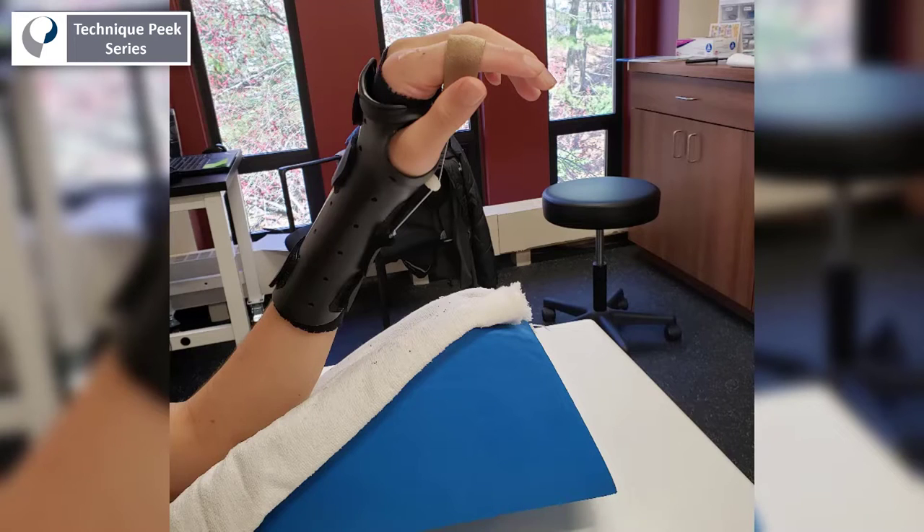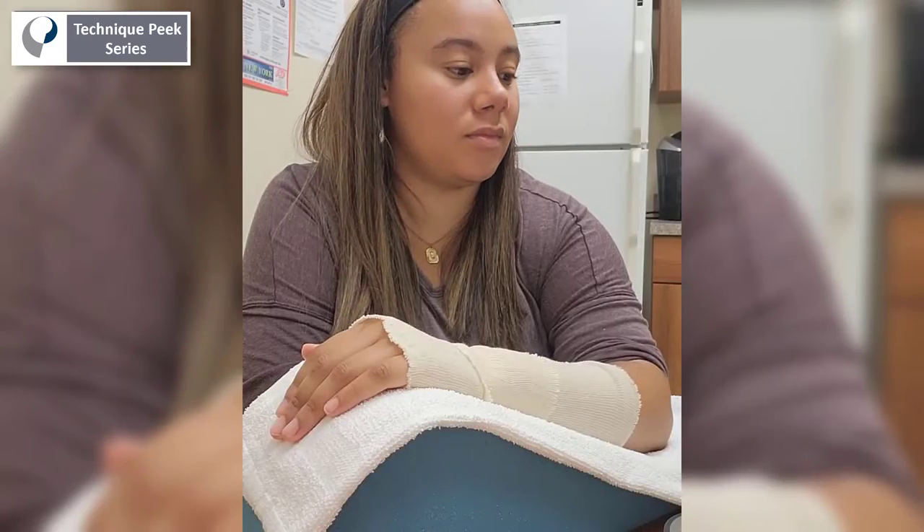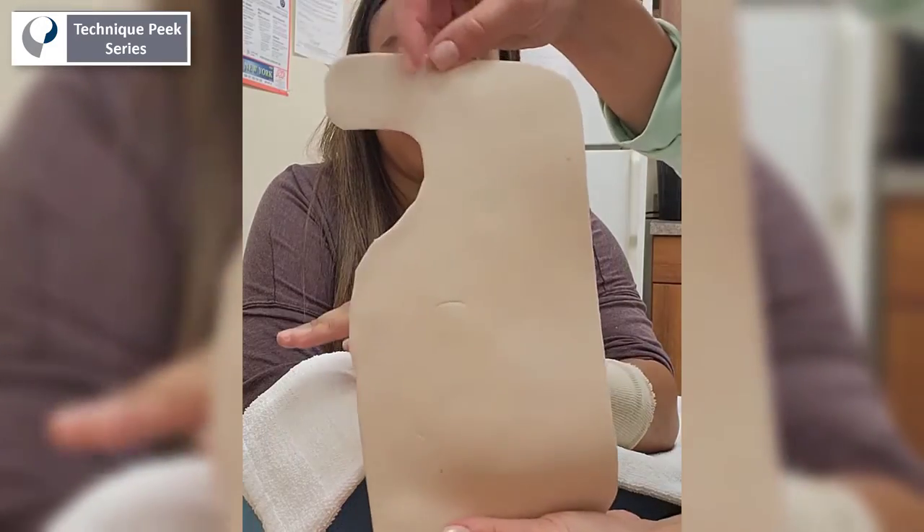Today we're going to look at how to make a static progressive MCP joint flexion splint. We start with the basic pattern for a radial bar version of a wrist cock-up splint.